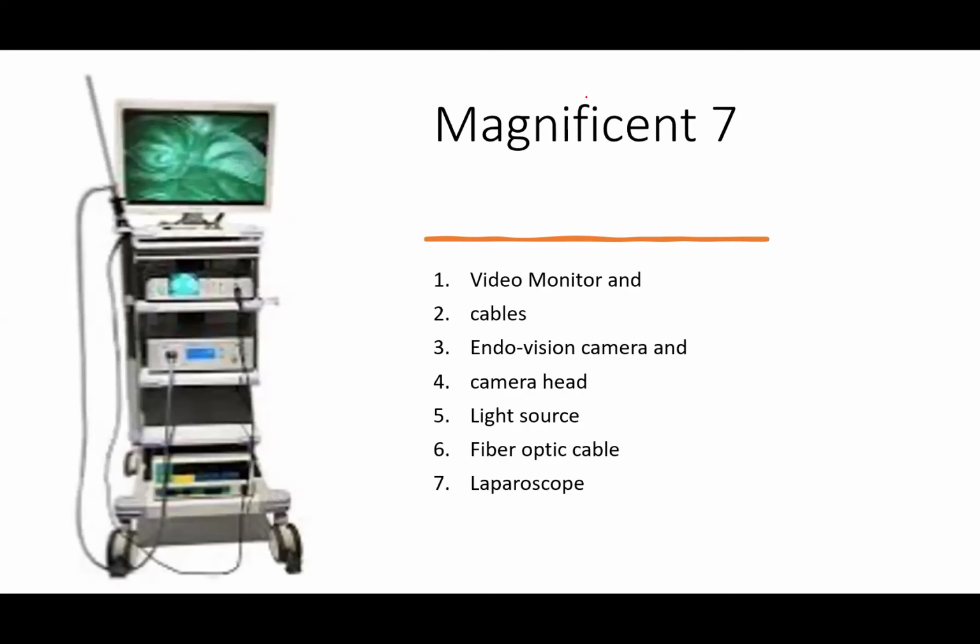So when you see a laparoscopic tower, you should ask for the Magnificent Seven. In any laparoscopic tower or any laparoscopic trolley, you should look for the Magnificent Seven, which is the video monitor and the cables. Without the cables, you cannot connect the monitor to other equipment.